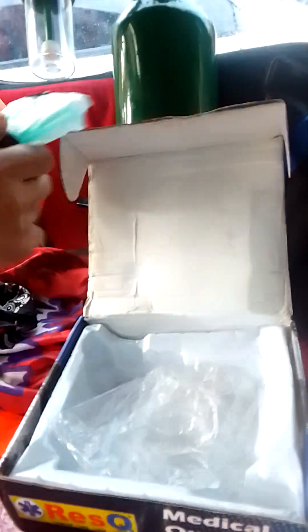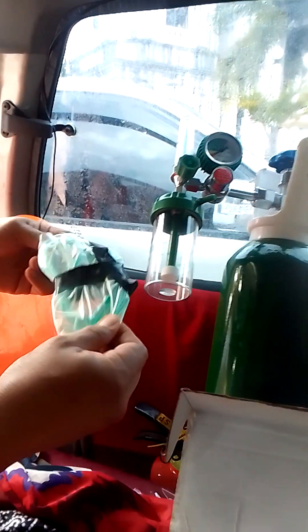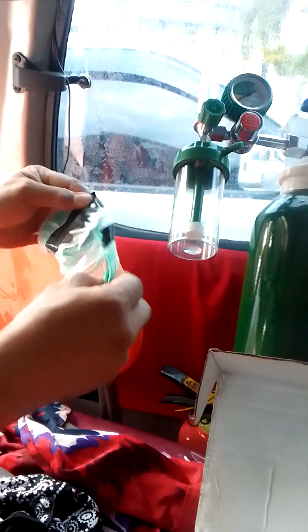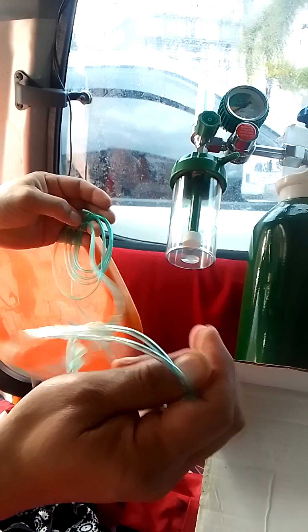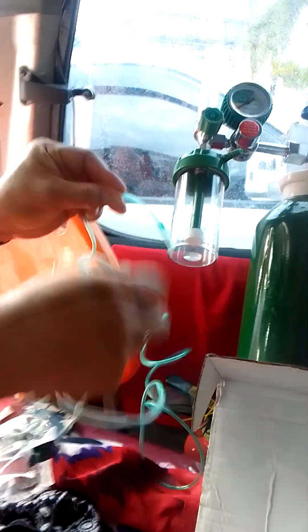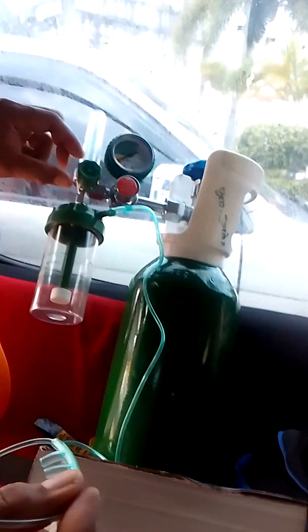This is called the cannula — never been used, never been touched. Basically you stick this into the port here and put this in the patient's nose. Once it's in the nose, you're ready to set the range.